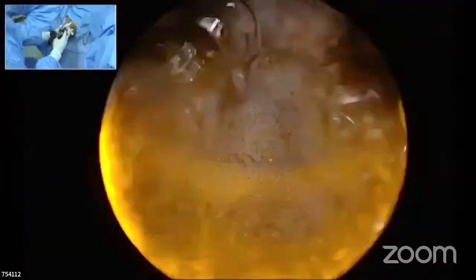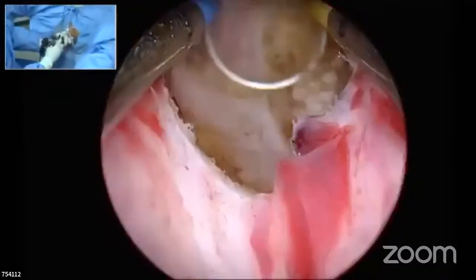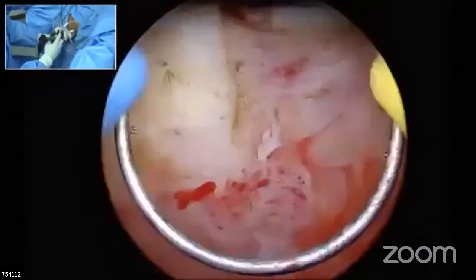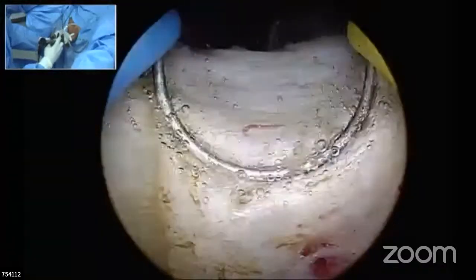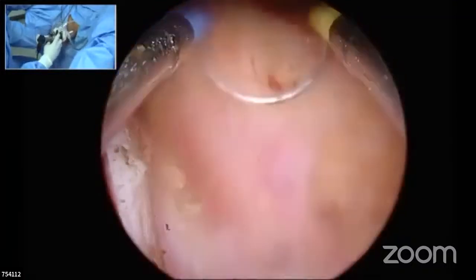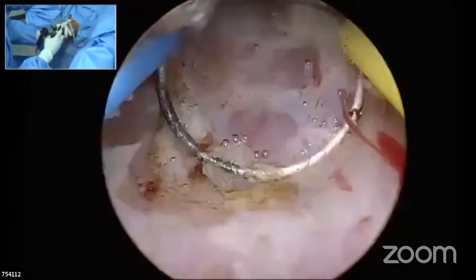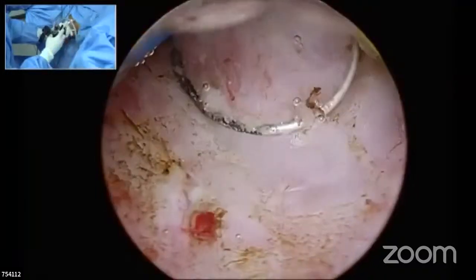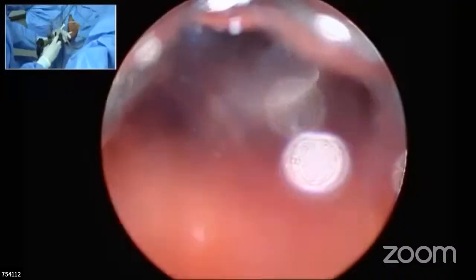So this is a resection of the median lobe, which is almost complete. This is the Veru, that's the prostate, and you see the median lobe, which is completely resected, and the bladder neck fibers, which are exposed. So that is the resection of the median lobe. Now you are able to see this is almost the plane of the capsule. You see this sort of a picture of corpora amylacea, or this sort of a cyst appearance, between the adenoma and the peripheral zone. That is the completion of the median lobe.